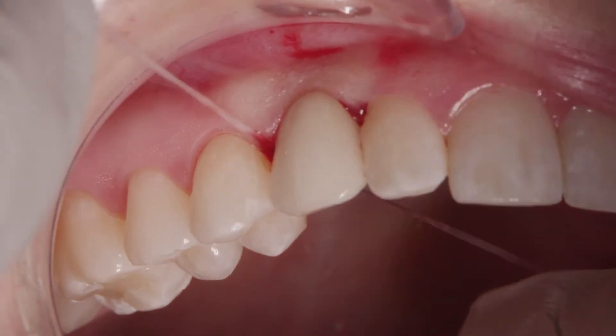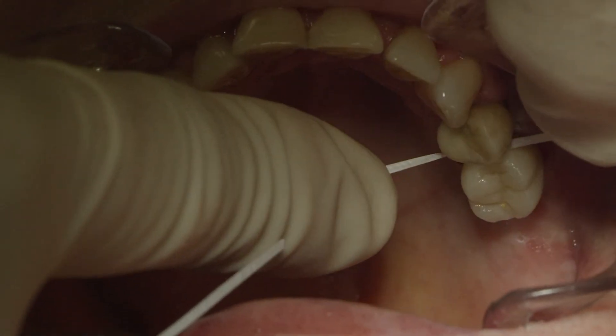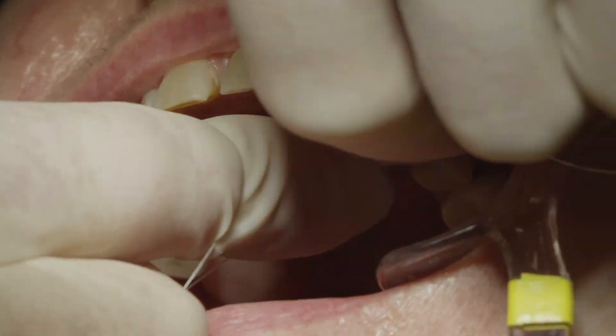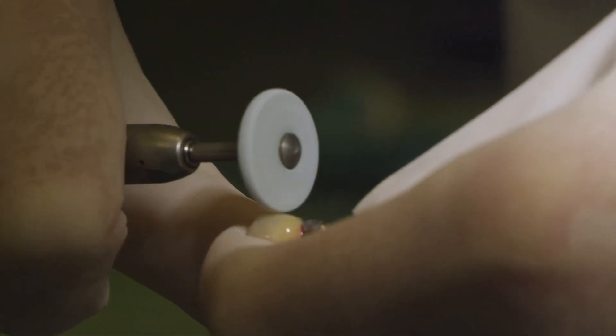This will make the soft tissue loose and facilitate the insertion of the crown. After inserting the crown without any soft tissue or bone interferences, it's time to make sure the interproximal contacts are adequate. You may check the contacts using a small piece of floss, which should pass through the interproximal contacts with the same resistance as natural teeth contacts. If the contacts are too tight, use a polishing or metal strip to correct the contacts. If the contacts are too tight to use a strip or you are restoring with a porcelain crown, remove the crown, place an articulating paper in between the crowns and adjust the marked areas until it is adequate.